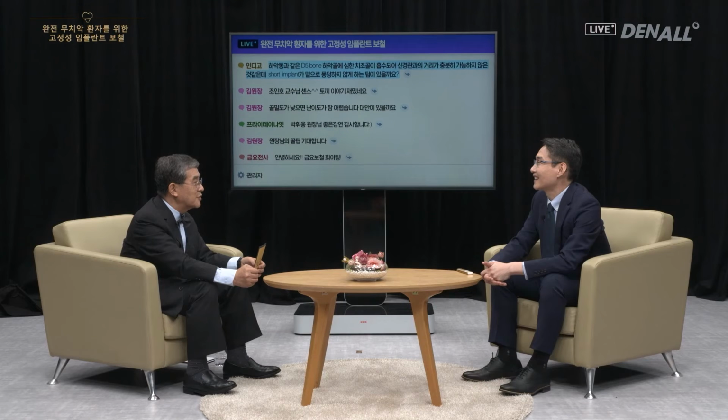A lot of people use subcrestal implants these days. However, if we use this, it could lead to chaotic mistakes. And in those cases, equicrestal implants can be used. Or there are other options that you can use, like soft tissue level implant, where these mistakes can be avoided. I believe you can utilize these kinds of designs. To give you an example, Ostem's SS implant has a structure and a design where it cannot fall in.